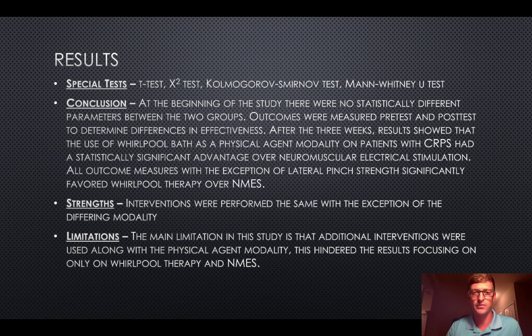After the 3 weeks, results showed that the use of Whirlpool bath as a physical agent modality on patients with CRPS had more statistically significant advantage over NMES for patients with upper extremity symptoms. All outcome measures were more directed towards Whirlpool therapy, except for lateral pinch strength, which was the same between both.